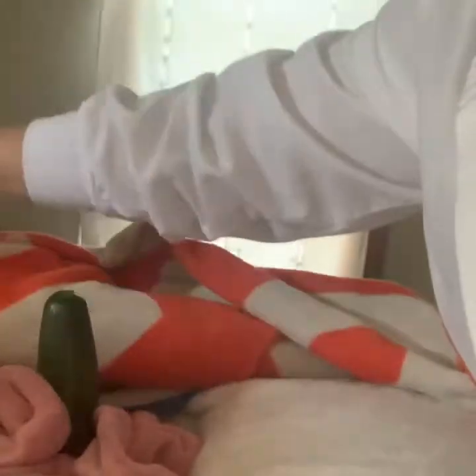This is something I did when I was a STNA, so I'm not sure if you want us to do it as a nurse, but we would check the side rails and pull them down, make sure the bed is locked so it doesn't move. And then we're going to expose — I've been calling him Mr. Penis. So I'm going to uncover the blanket to expose him. I have a cucumber as my model today. I would also bend his legs up — we're going to pretend they're bent up. And then we're going to start the second half of this video.